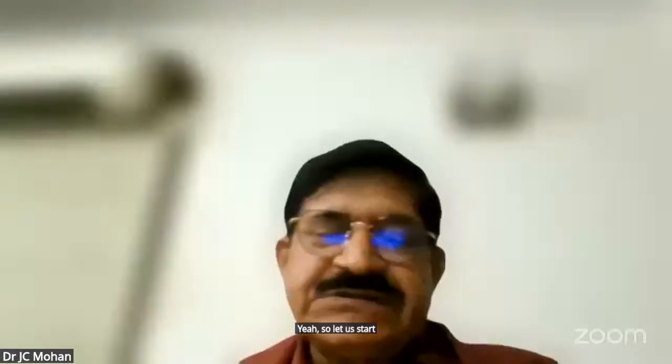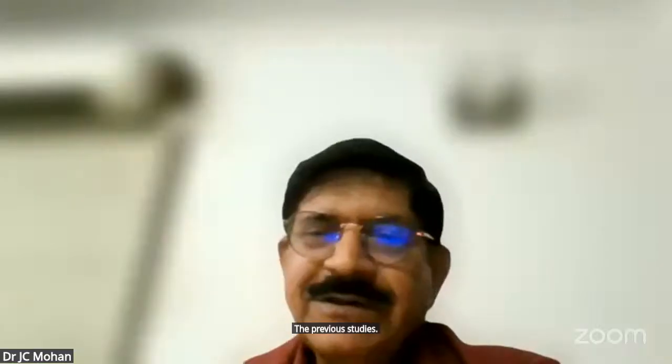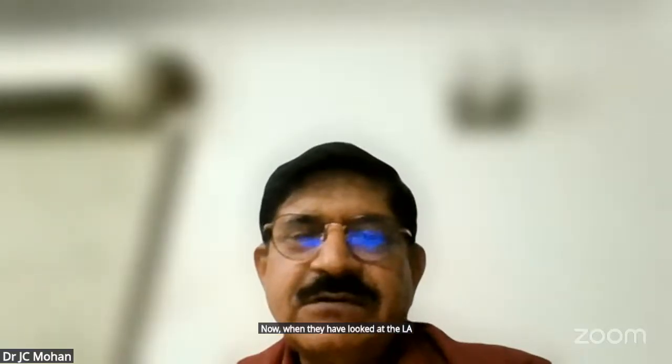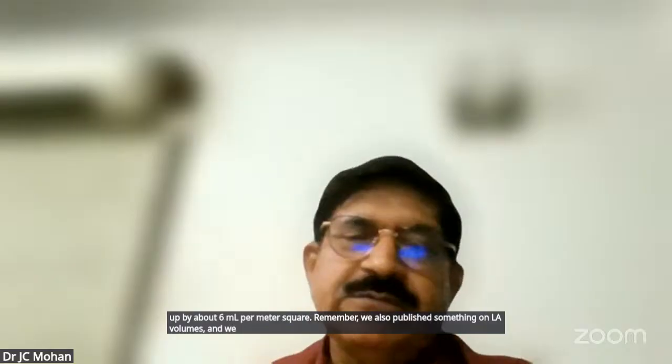Yeah, Dr. JC, please. So let us start with the last question. The new range is based upon LA focused views for the volume. The previous studies were not LA focused volume. Now, when they have looked at the LA focused volumes, obviously the volume goes up by about 6 ml per meter square. Remember, we also published something on LA volumes, and we were surprised that our LA volume was small because none of us did that study with focused LA volume.